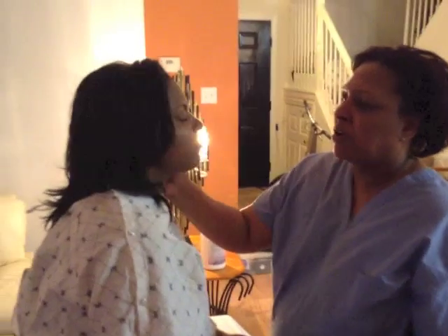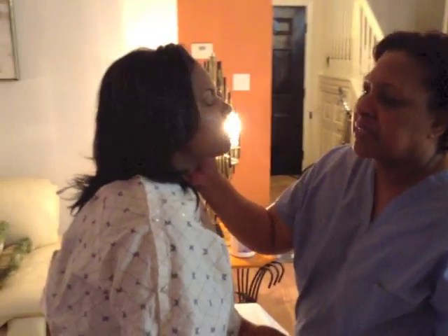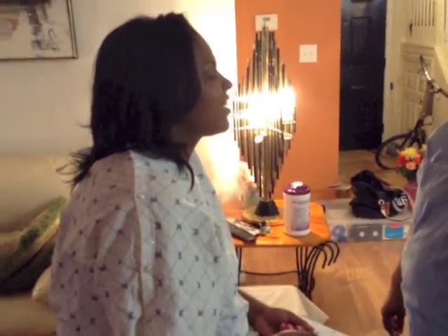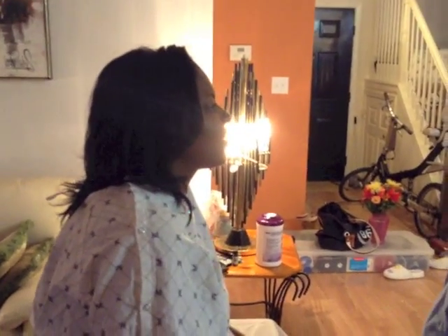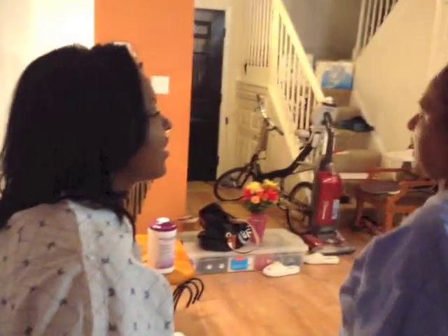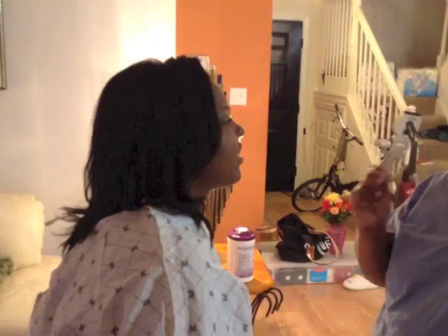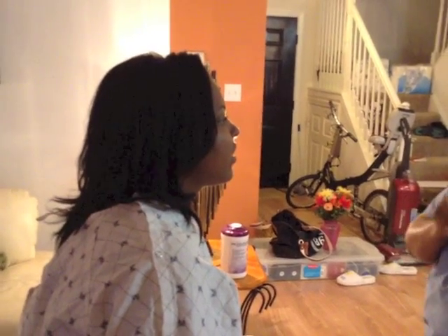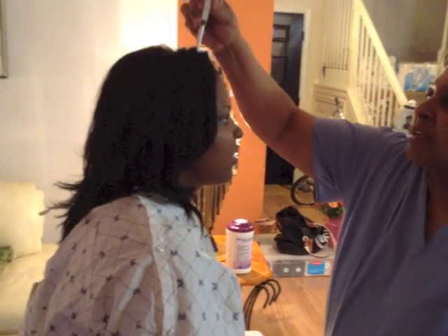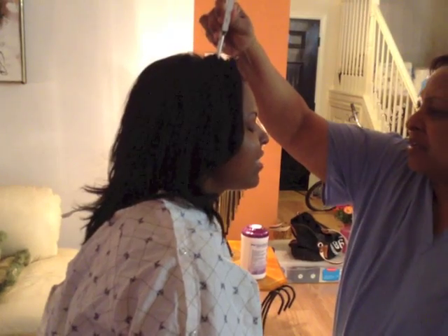Close your eyes. I'm going to do the voice test. And I want you to tell me if you hear what I'm saying. Repeat after me. Okay, very good. So now I'm going to do the Weber test. What I'm going to do with the Weber test is test for transmission to your ear and your skull. And I'm going to use the tuning fork. I'm going to hit this right here. And tell me, can you hear it in both ears? Can you hear it in both ears?